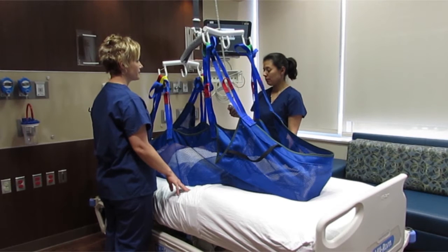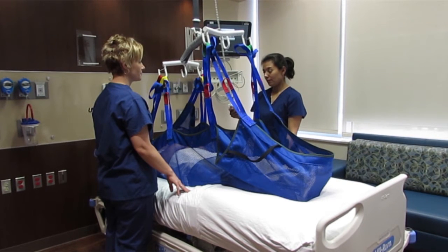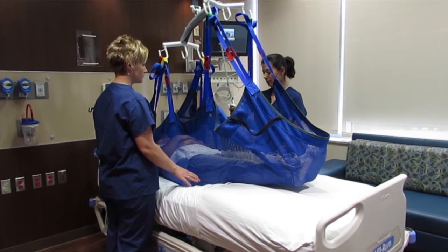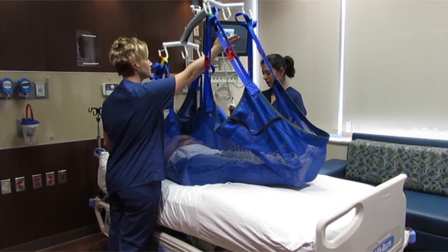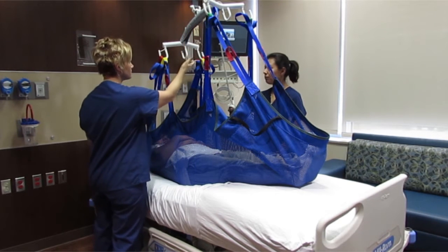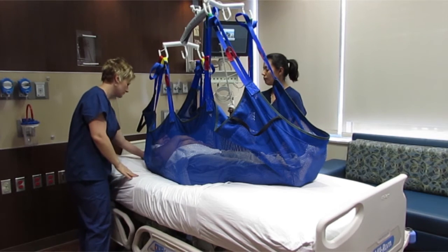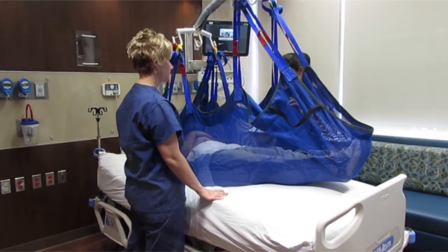Pushing the up button on the handheld pendant, raise the patient up one to two inches off the surface, then stop and check to make sure all the straps are hooked correctly on each side. Also check the placement of the patient's neck, making sure the neck is not hyperflexed and occluding the airway of the patient, especially if trached or on a ventilator.